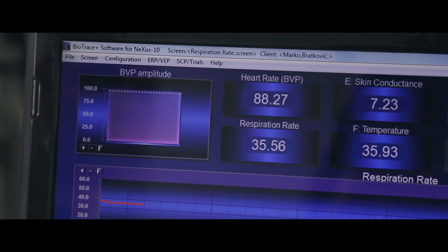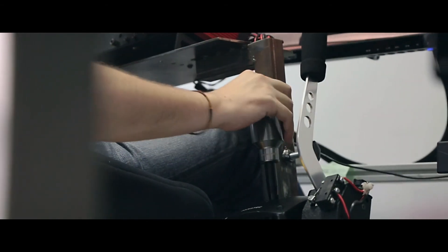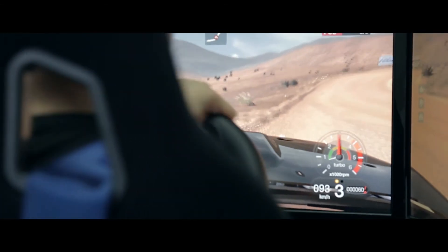Our driver currently has a noticeably raised heart rate, his skin conductance level is above normal so he's not relaxed — he's very activated. His respiration rate is much higher than normal, meaning he's breathing very shallowly and quickly. Interestingly, his muscles are actually relaxed because his finger temperature is quite high, so it looks like he may also be enjoying this ride.